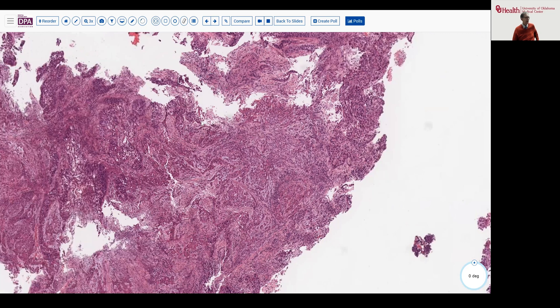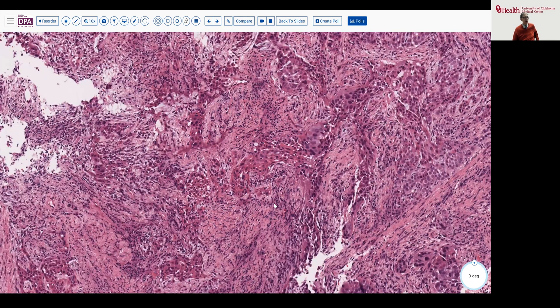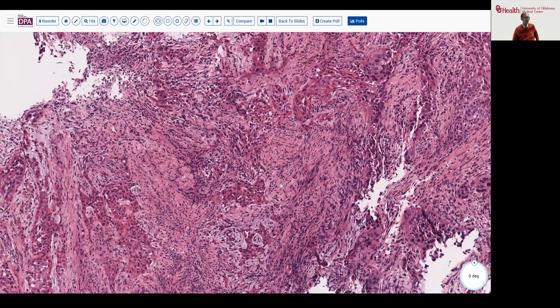Because of her age group, she's certainly at higher risk for this to be a non-HPV-associated tumor. Based on that alone, we would strongly recommend doing pertinent immunohistochemical stains to differentiate the two. We also considered solid forms of adenocarcinoma, so we performed three immunohistochemical stains.